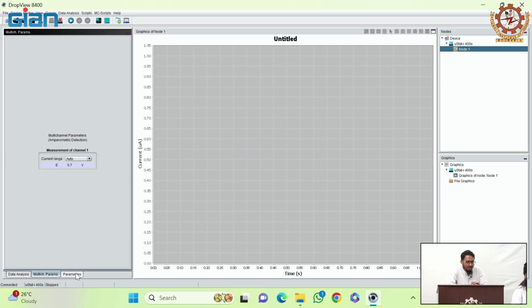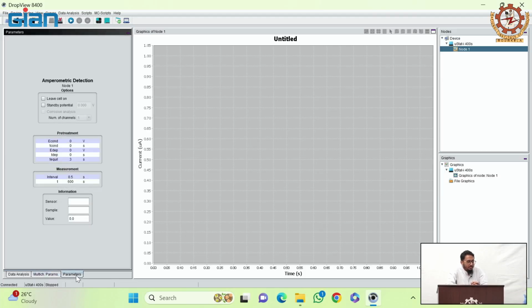Yeah, we can start. 600 seconds. We'll be running it for 600 seconds. So we'll be running the stabilization step for a bit long, around 600 seconds. So it will take a long time to complete. Approximately 10 minutes.